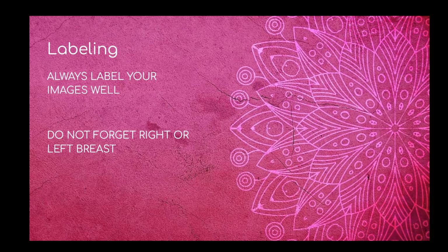When I was first scanning ultrasound, we did a lot of breast work, and I found a lesion right where we were looking and got everything set up for the breast biopsy, and then we went to go in, and I had moved a little bit more out to the axilla, and we actually found a second breast lesion out in the axilla. So then we were kind of like, well, which one were we supposed to do? Because they were kind of in between the measurements, the centimeters from nipple.